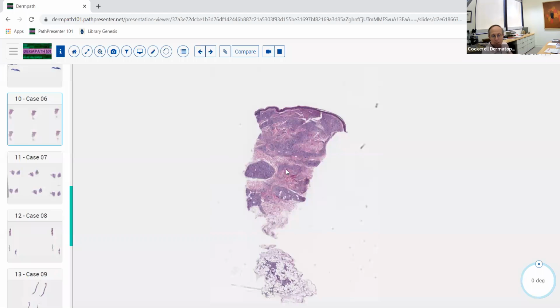So you get a really brisk inflammatory reaction with epithelioid histiocytes with very few organisms. Many of you don't find any organisms. And then you go from the tuberculoid pole to the lepromatous pole. You kind of go through the borderline stage where you get features that look a little bit like lepromatous, a little bit like tuberculoid, fewer sarcoidal granulomas, more cells that may have some foamy histiocytes in there that may have some organisms. So when you go from borderline tuberculoid, few organisms, borderline lepromatous, you get more and more organisms.